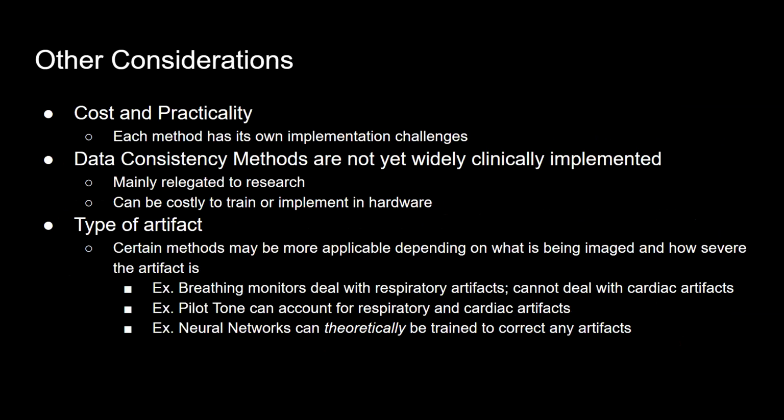Okay, so just a few considerations about what method you should actually use. There's obviously cost and practicality. Each method has its own implementation challenges. If you can tell someone to hold their breath and that works for respiratory motion artifacts, then that's fine. That's all you need to do.